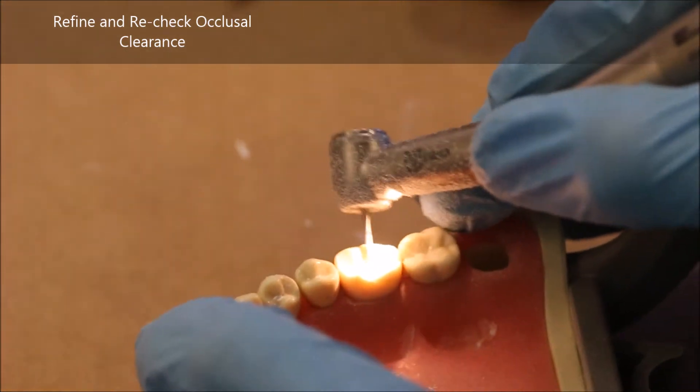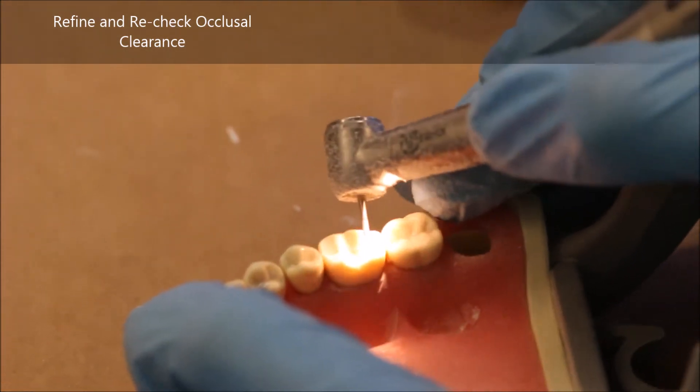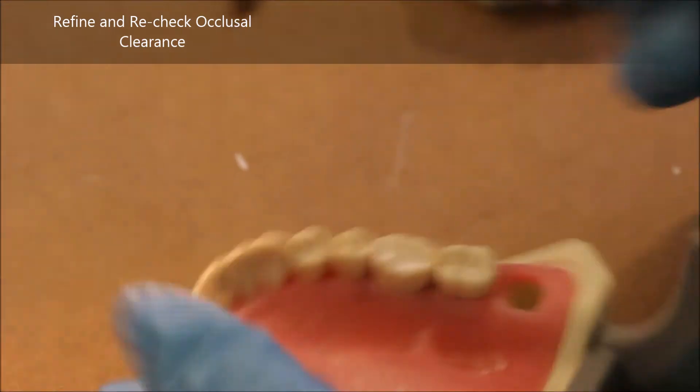When touching up these specific cusps, make sure that every time you do a little more occlusal reduction, you will also have to increase your functional cusp bevel.